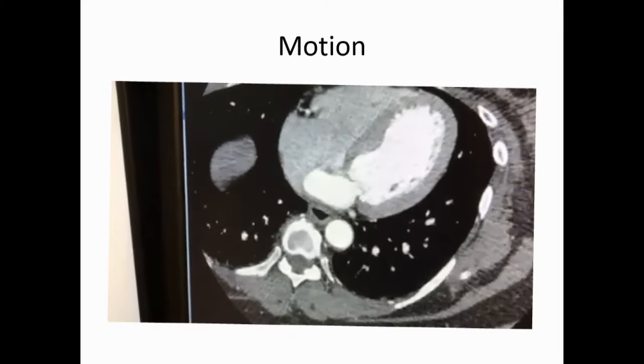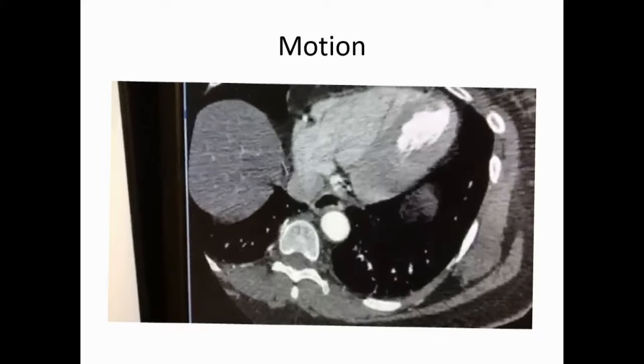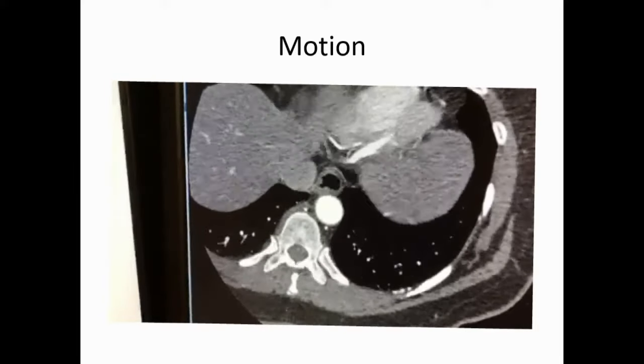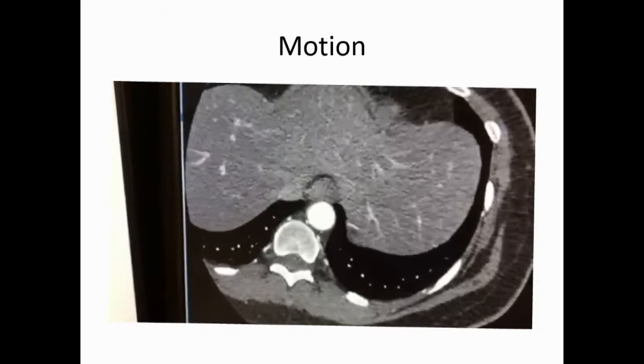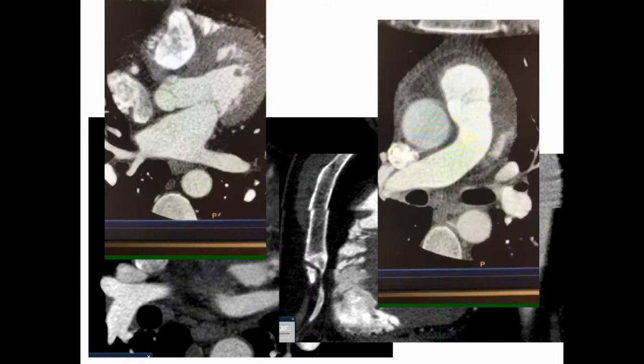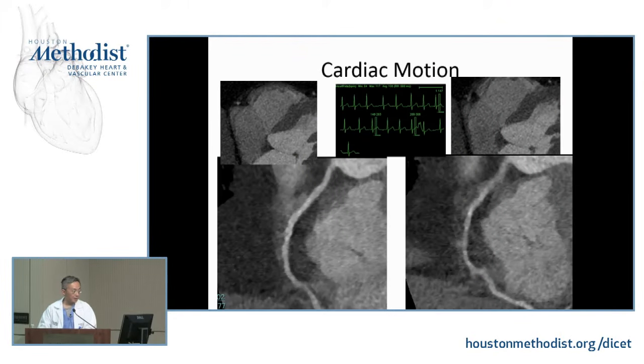significant, the motion. You can notice a little jump right there, for instance, okay? And then, let me see, right there again. So this motion most likely is due to patient motion, as you can see here. This is almost uninterpretable. You can tell it's patient motion because, again, there's a movement of the sternum, okay? Okay, so this is just another example.